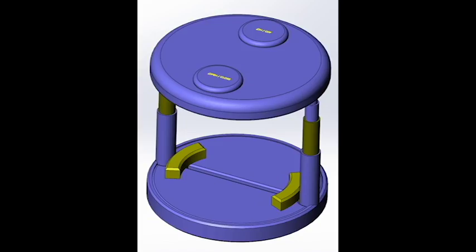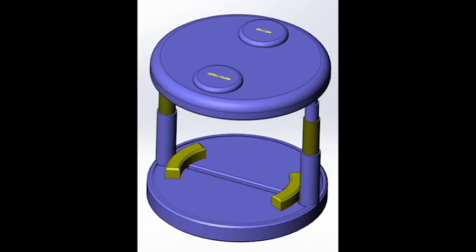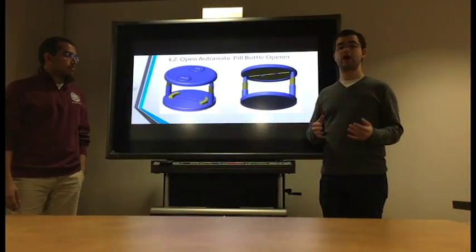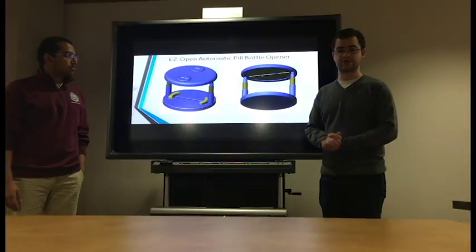Well, have no fear. Introducing the EasyOpen Automatic Pill Bottle Opener. We have developed a revolutionary new product that will solve the problems for the old, weak, and frail. The objective of the device is to remove a child safety lock cap on a pill bottle for a user that's unable to open it for themselves.